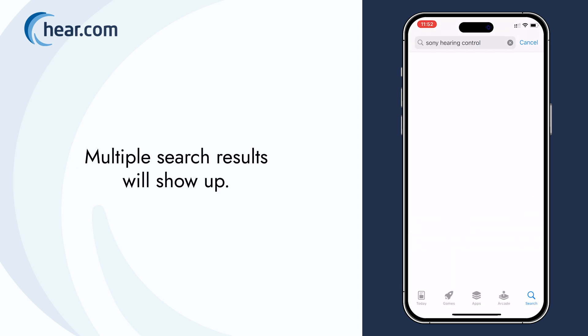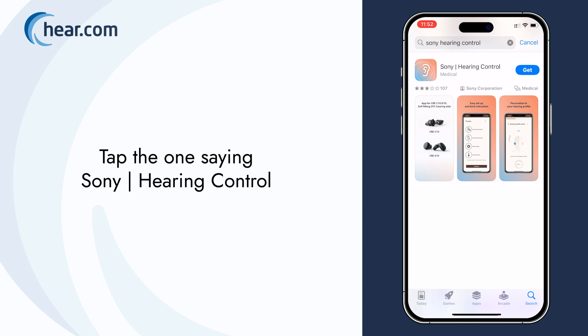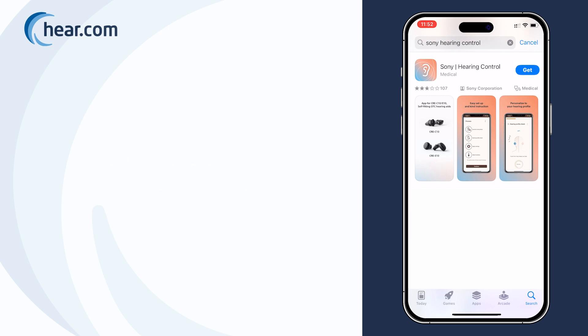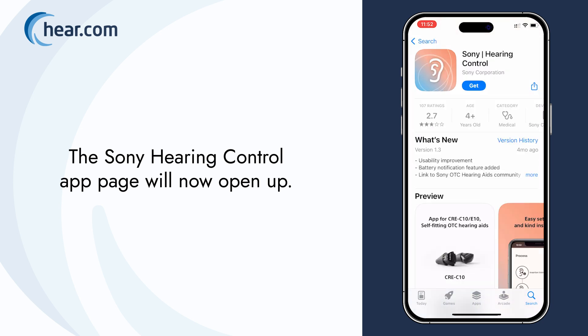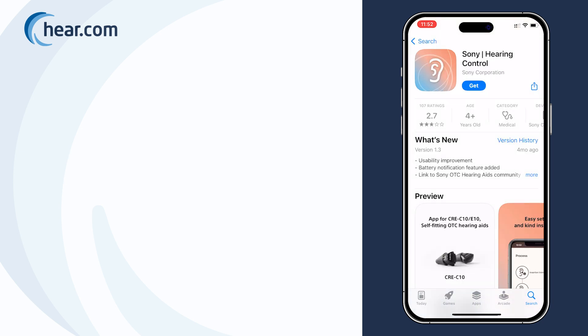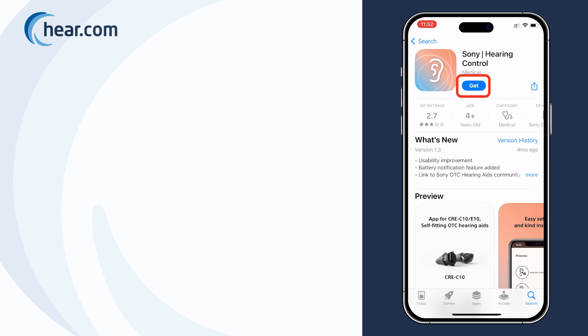Multiple search results will show up. Tap the one saying Sony Hearing Control. The Sony Hearing Control app page will now open up. To download the app, tap the blue Get button.